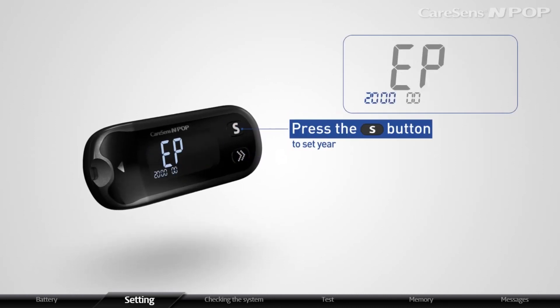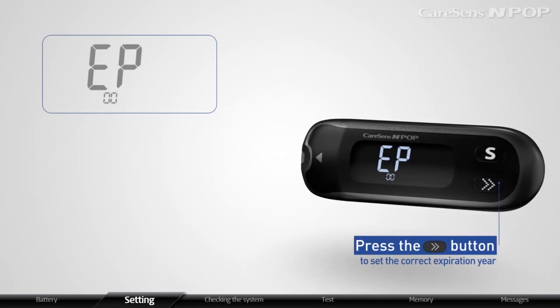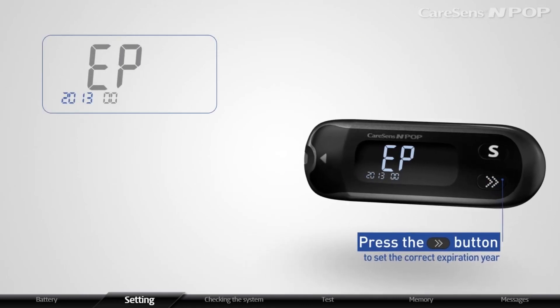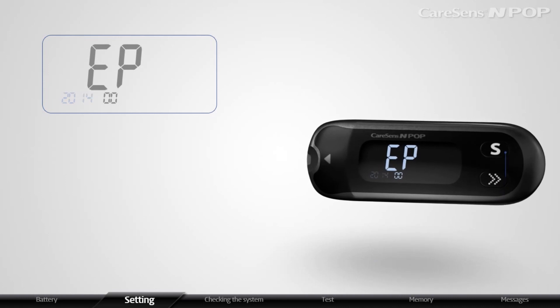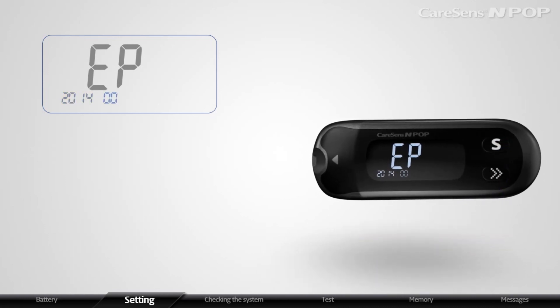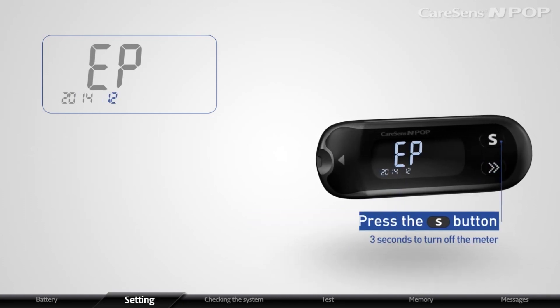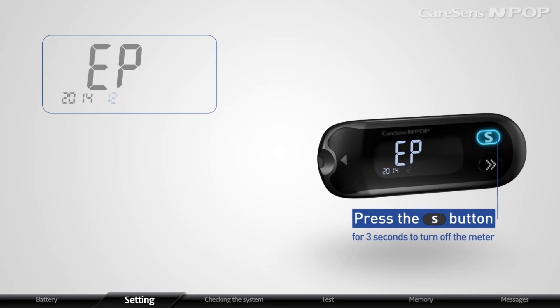Press the S button to set the year. If the year blinks, press the arrow button to set the correct expiration year. After setting the year, press the S button to set the month. Set the correct month with the same method, and press the S button for 3 seconds to turn off the meter.